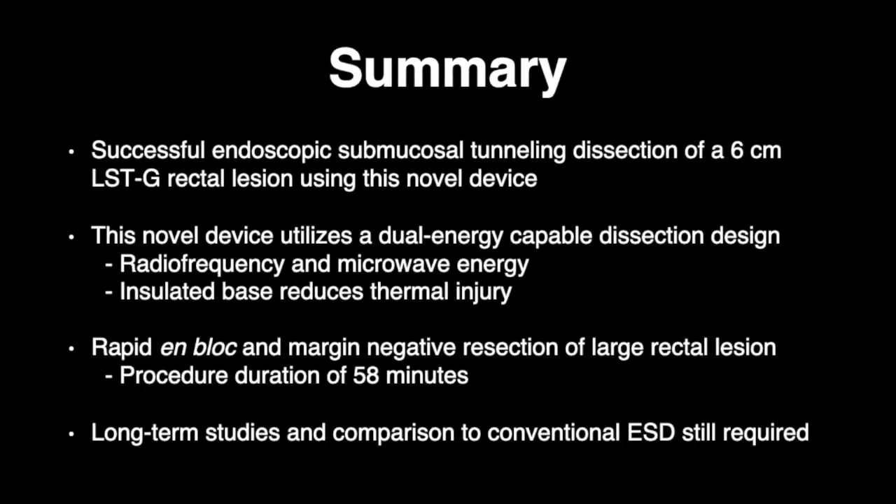In this video, we demonstrate successful en-bloc resection of a large 6 cm rectal LSTG lesion using a novel endoscopic submucosal tunneling dissection technique. The device utilizes a dual-energy-capable dissection design to perform precise radiofrequency dissection and microwave coagulation for hemostasis. Successful en-bloc resection of this large rectal lesion with endoscopic submucosal tunneling dissection technique is accomplished in under an hour. Still, long-term data and larger experience with this device, as well as comparison to conventional endoscopic submucosal dissection techniques, should be performed.